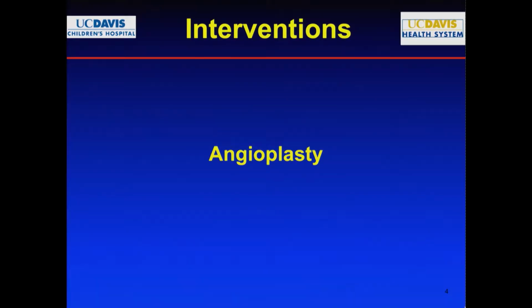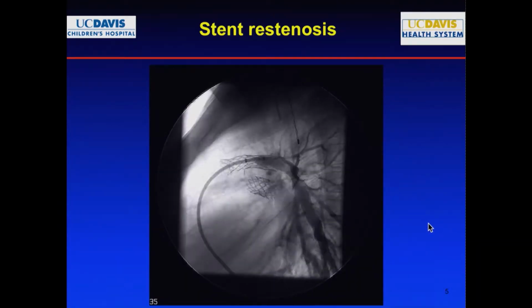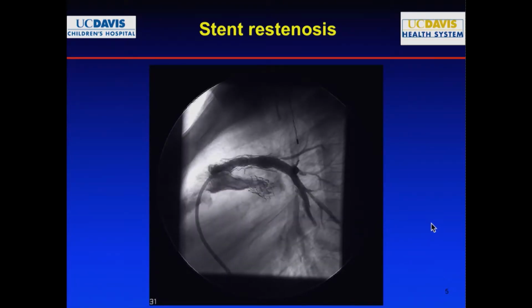This is in part 2 now. So here's an example of a stent in the PA, in the left PA. So here we're going to balloon it. So what do you have to think about when you inflate the balloon there? Again, feel free to answer, because this is meant as interactive. I know that we only have 30 minutes.